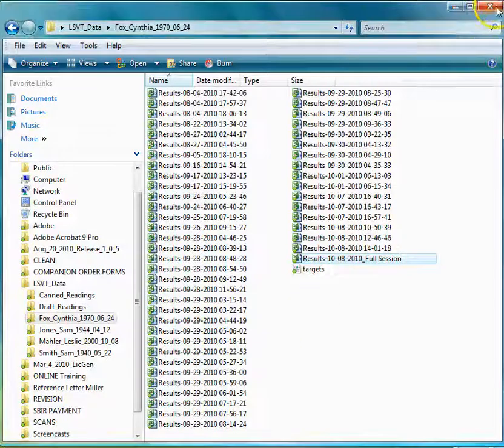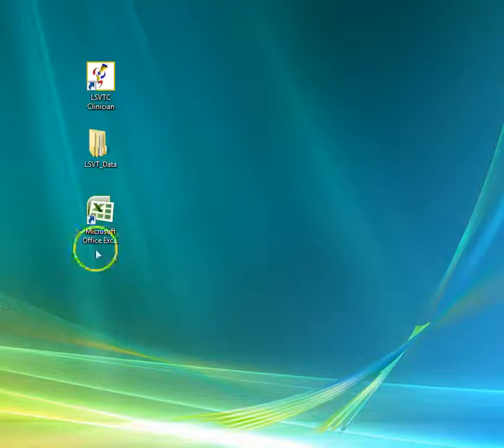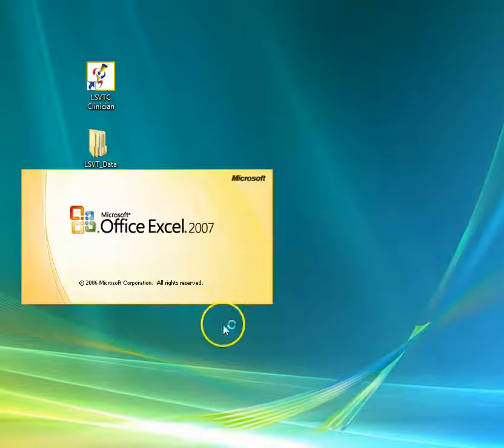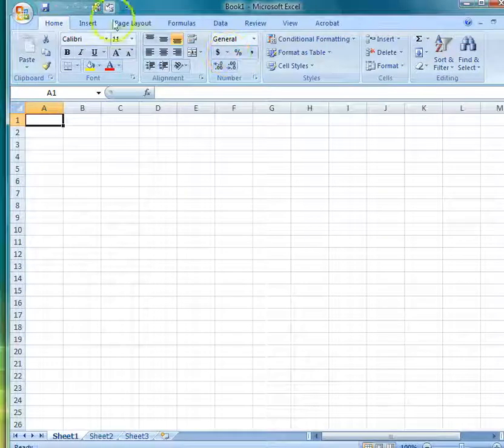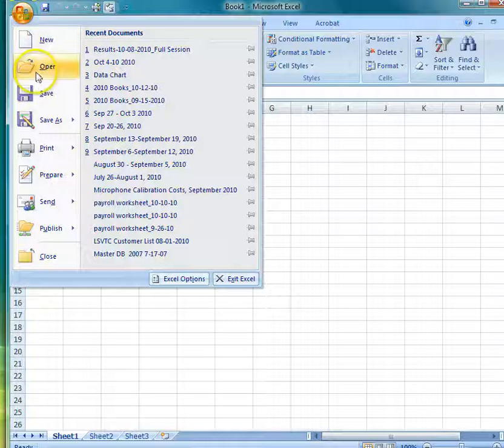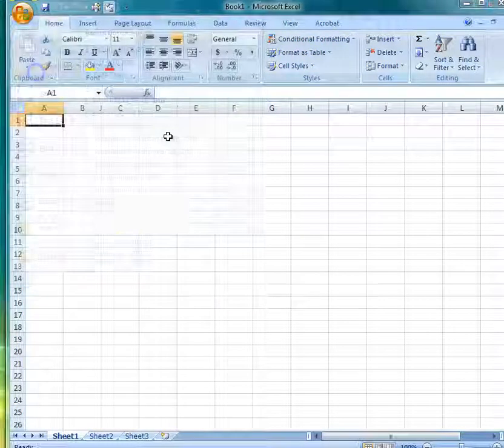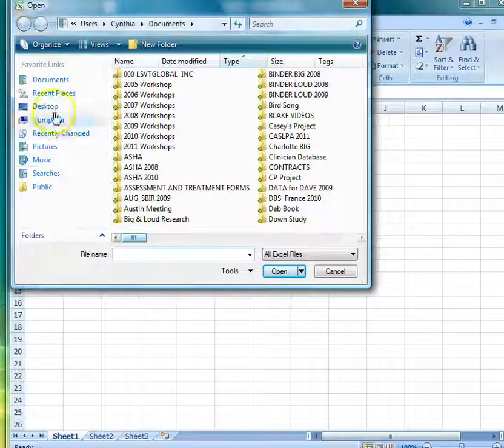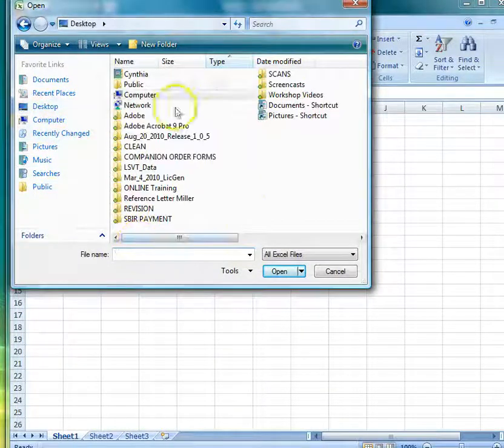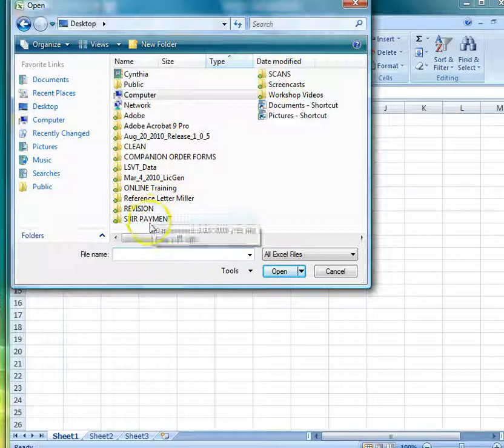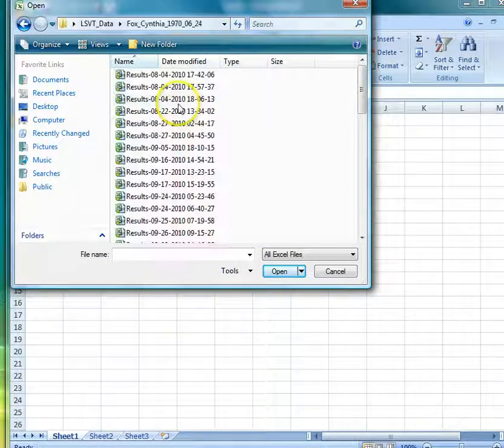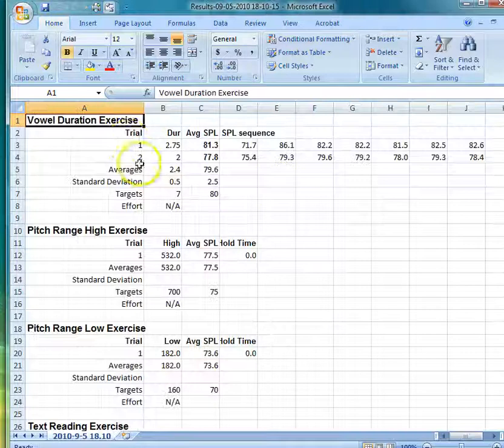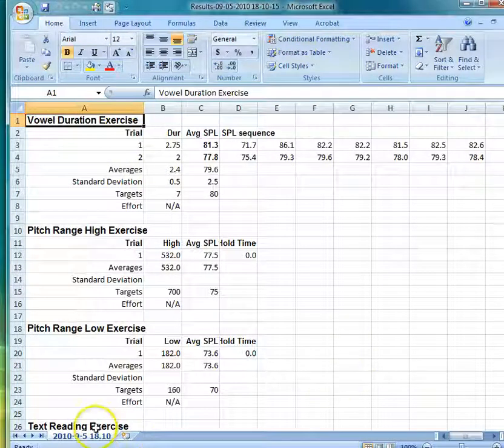The other way to open those files is you may need to launch the Excel program first, and then you can go in and do an open from file. Go to your desktop, find your LSVT data folder, and in the same way, open a session file. We'll just pick one here, and you can see the data that were collected.